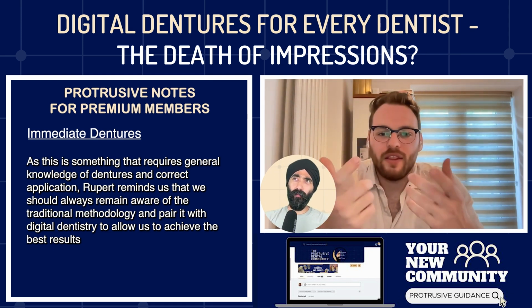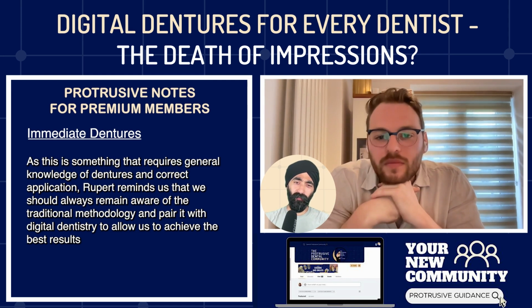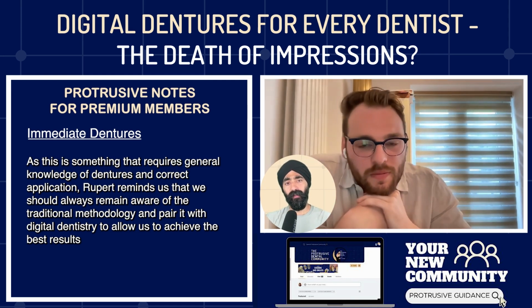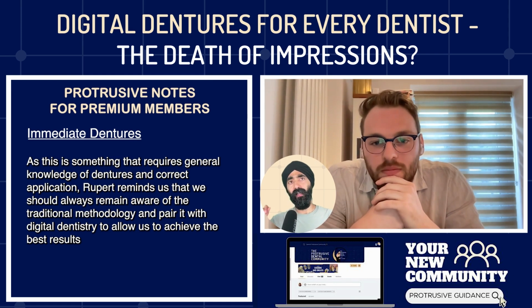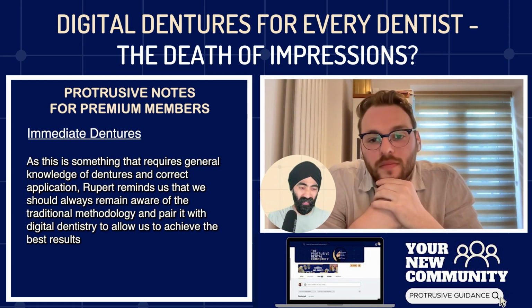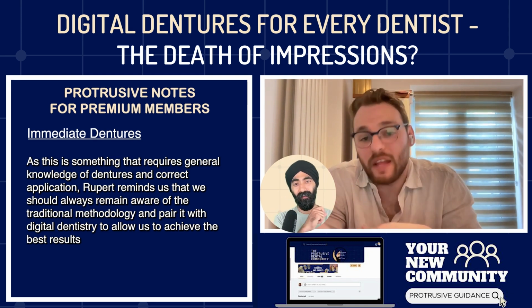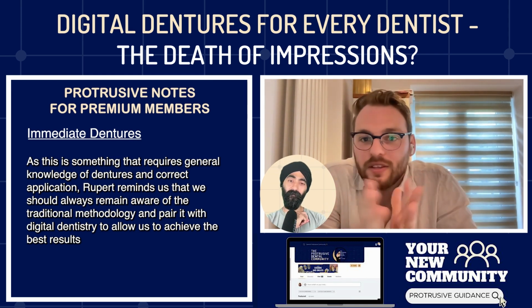So maybe we're talking about different brands. I really like the Coltene one. Have you used that one? The greenish one? Yep. Okay. Because that's fairly fast setting. That's kind of like a fit checker, quite fast set. But there's another one that's white, almost like toothpaste. That's horrible. That works well for the ulcer, I find. Yeah, that's for the ulcer. So there's different ways to do it.